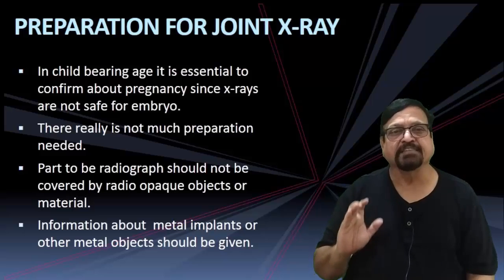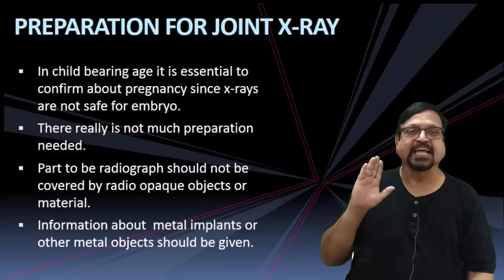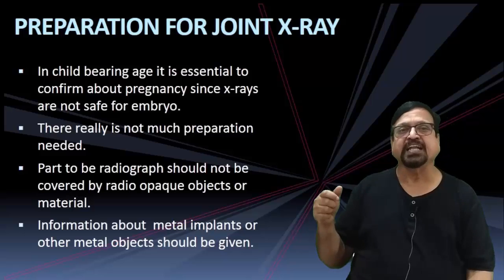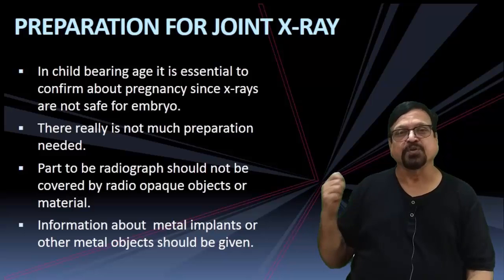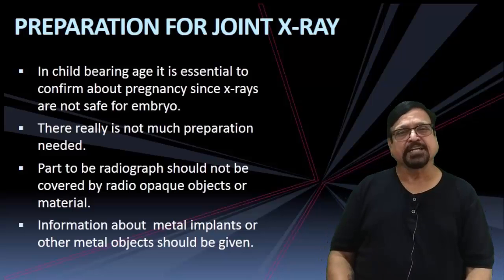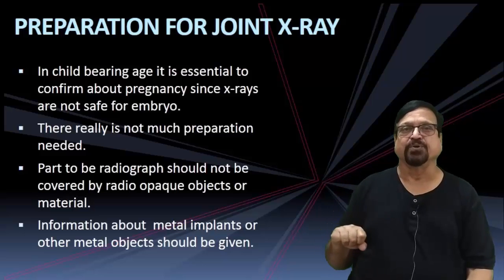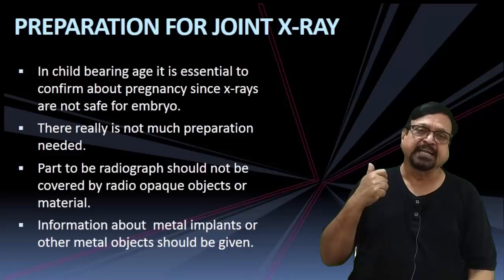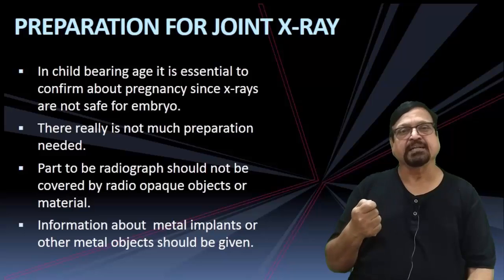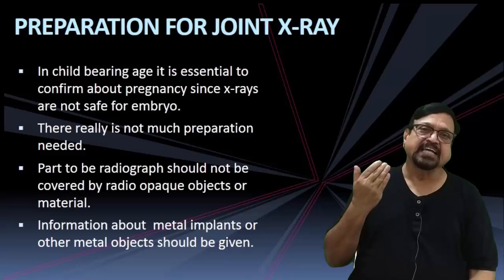Sometimes it is evaluated with X-ray, and sometimes we have boards in the X-ray department where it is clearly mentioned that if patients are pregnant, they should inform the radiographer and the referring consultants before coming to the radiology room. Otherwise there are no real preparations required for joint radiographs. A painful joint history needs to be taken before, because we are sometimes going to make the leg straight or the arm straight. It may be painful, and it may not be possible for the patient. These things have to be taken care of before taking the patient to the radiographic room.